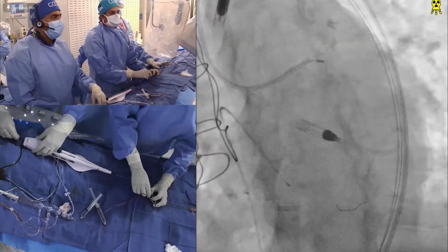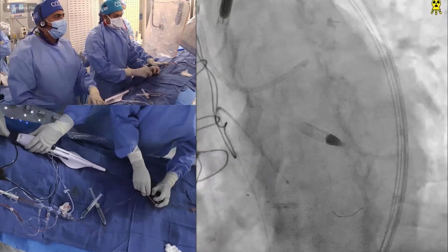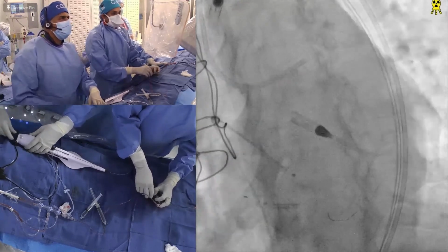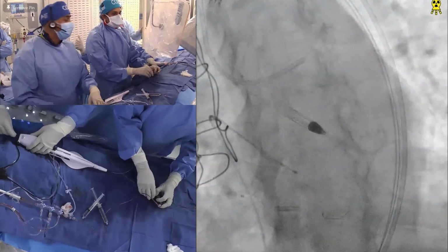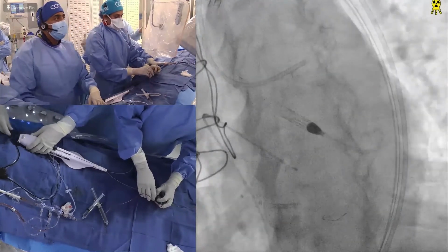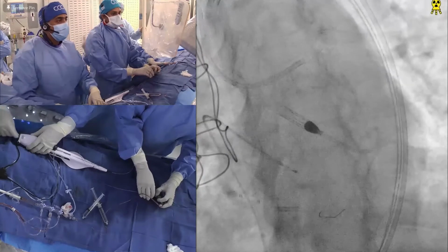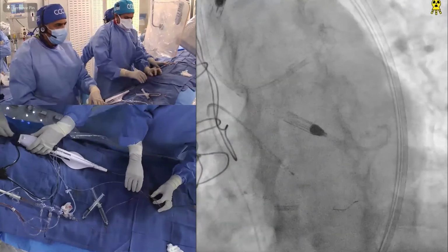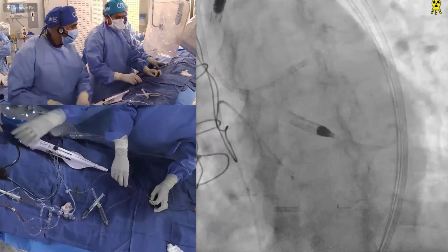But I will say that once available, this Impella is approved for this kind of protection. So two things. One, complication, and secondly, in a long calcific lesion, it decreases the slow flow. So that is the key. It will decrease the overall chance of slow flow in this very complex case.